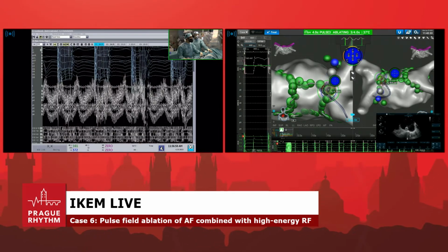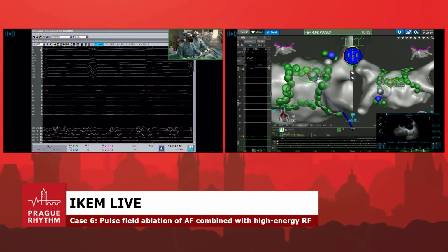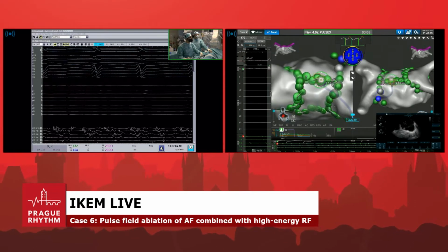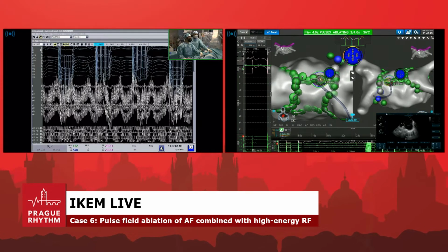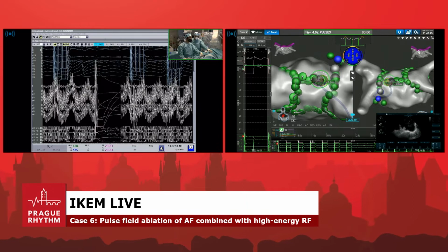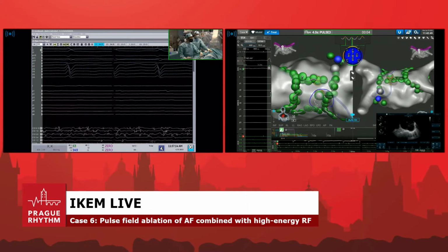But it doesn't mean that you should not ablate in that area. So we just go visually, make one more lesion overlapping here and cover all these areas. It's something we do with RF anyway. We don't leave any visual gaps.